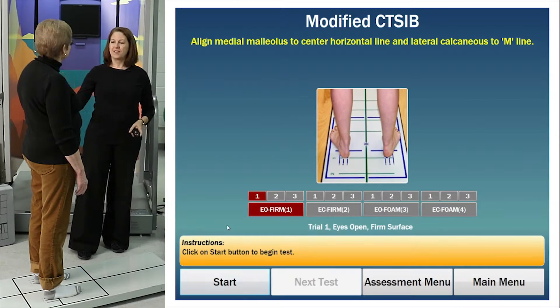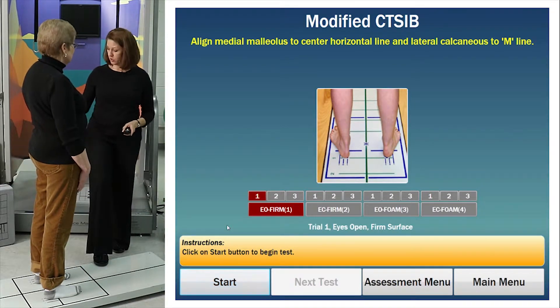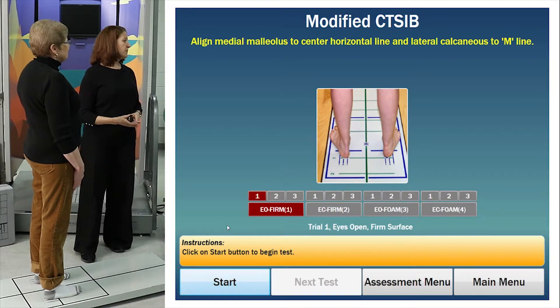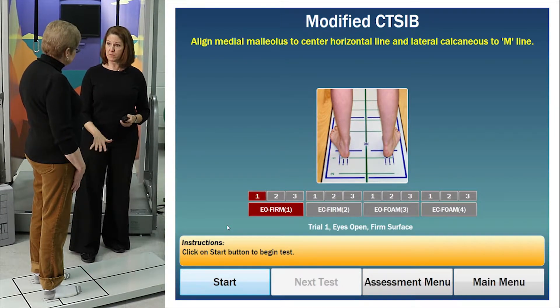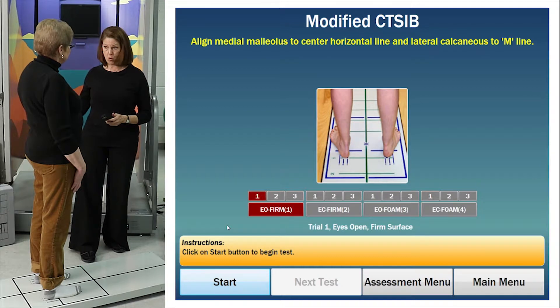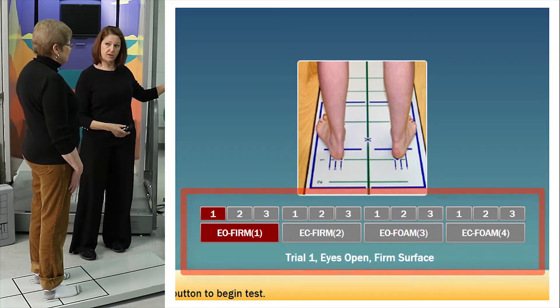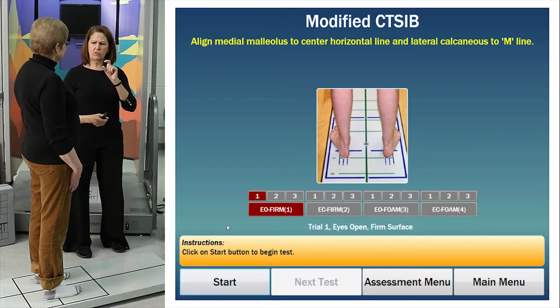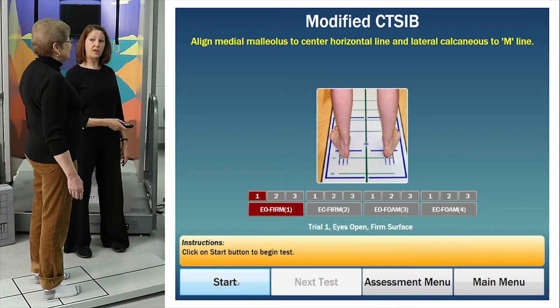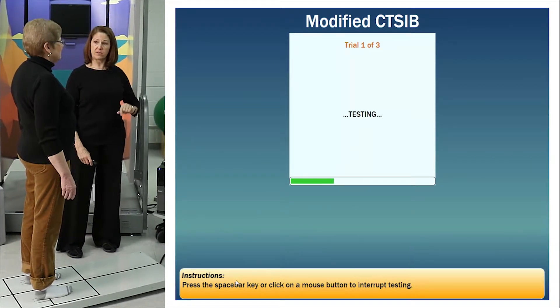This test has four conditions. Two of those test conditions are going to be on this hard firm force plate and two are going to be on a piece of foam, which makes it a little harder and adds more unsteadiness for balance. For the first condition and each condition on the firm surface, you're going to do some of the trials with your eyes open and some with your eyes closed, and the same thing on the foam. Under those four conditions you get three tries of each one. Each little trial is only ten seconds long.